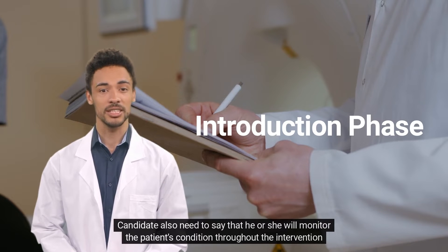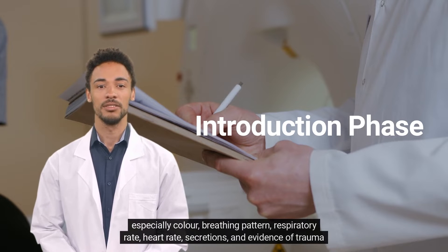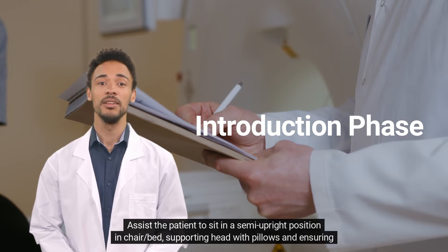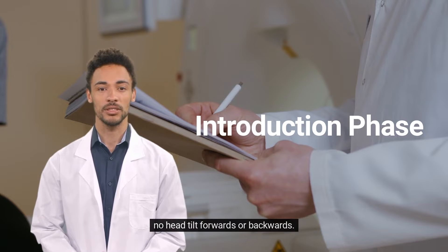The candidate should also state that they will monitor the patient's condition throughout the intervention, especially colour, breathing pattern, respiratory rate, heart rate, secretions, and evidence of trauma and distress, using pre-suction baseline observations as a guideline. Assist the patient to sit in a semi-upright position in a chair or bed, supporting the head with pillows and ensuring no head tilt forwards or backwards.